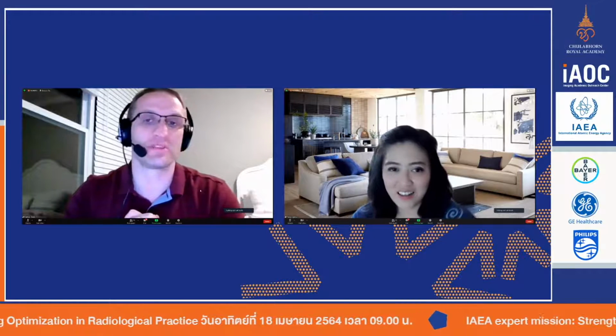When you push continuous, it's actually not true continuous. It's actually 30 frames per second, 30 pulses per second. So the dirty secret is it's not true continuous. True continuous is kind of hard to find nowadays. If you have mostly modern equipment, I bet you do not have continuous options anymore. You have 30 pulses per second or anything lower, say 15 or 7.5. So everything I showed you, this whole idea of continuous 33 milliseconds, unless you have an old system, you don't have that option.